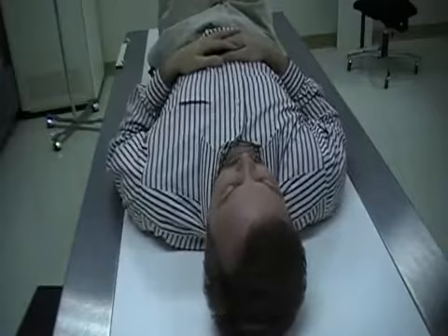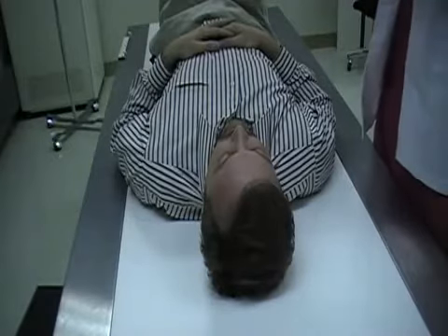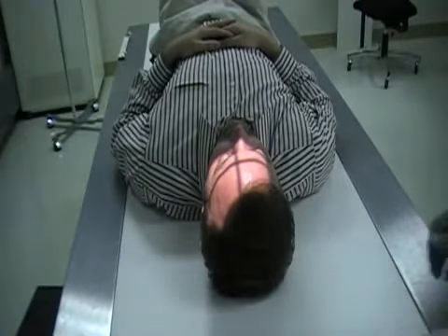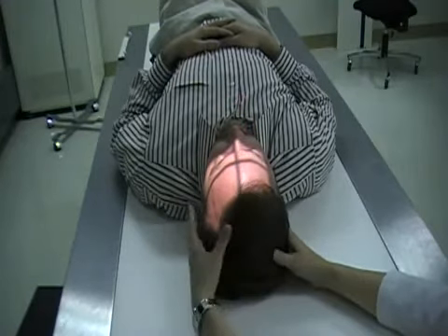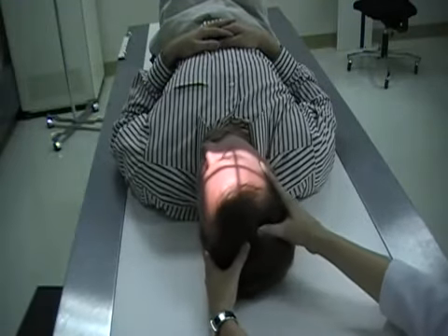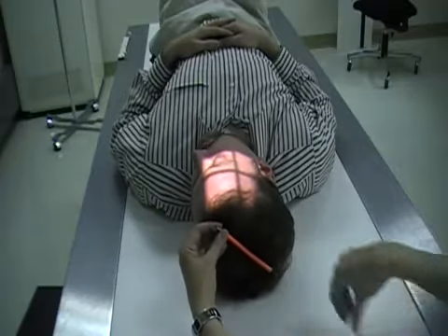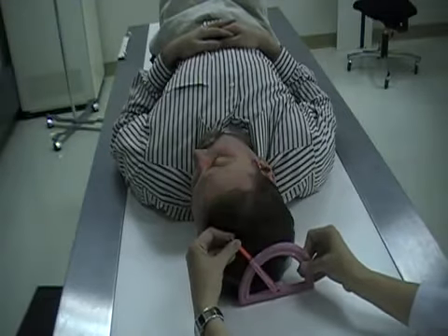With the Arcelin method, you're going to angle your tube 10 degrees caudal. Check the head and make sure the mid-sagittal line is straight and the head is not rotated. Then you're going to do a 45-degree turn of the head. If you want to check where your mid-sagittal is, get a pencil, set your protractor down, and make sure that the two of those coincide.